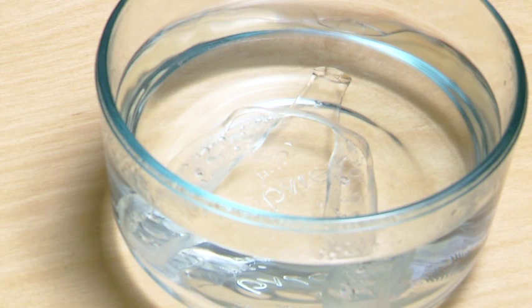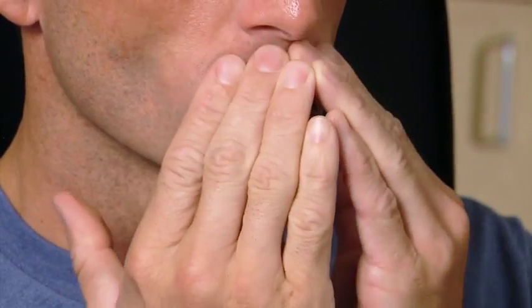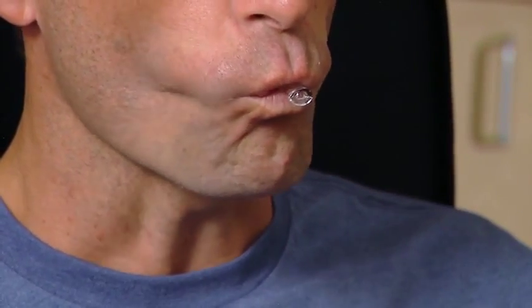If the trays are too loose, reheat the trays and repeat the fitting process. When you place the tray in the mouth, bite down firmly. Then press the tray harder against the teeth with your fingers and tongue. You may also need to suck on the tray to achieve a tighter fit.